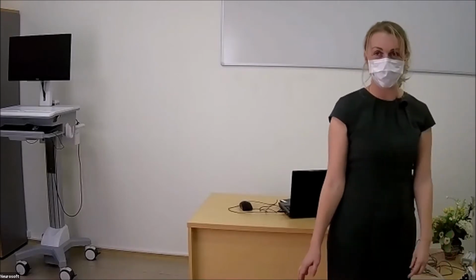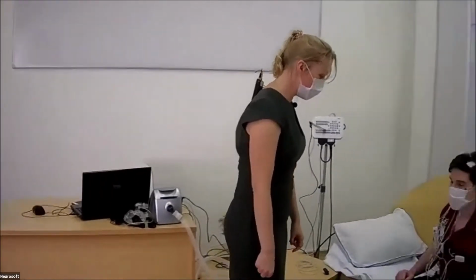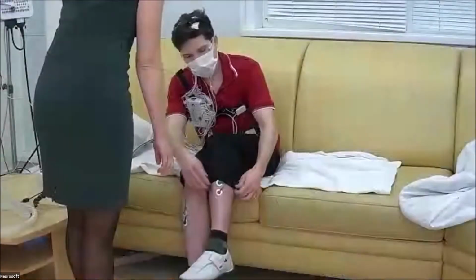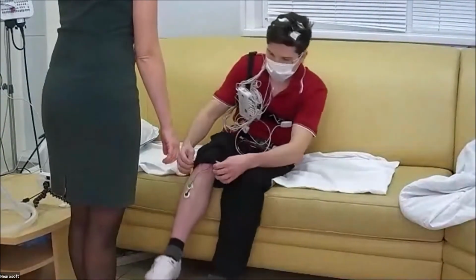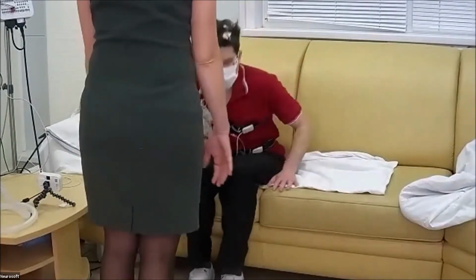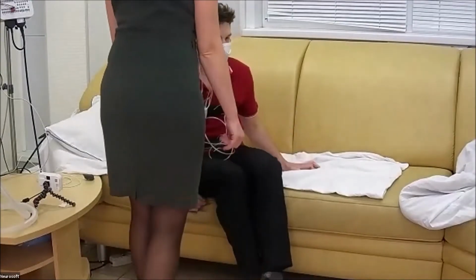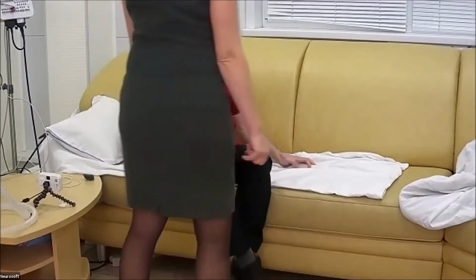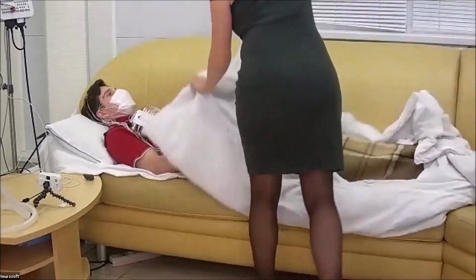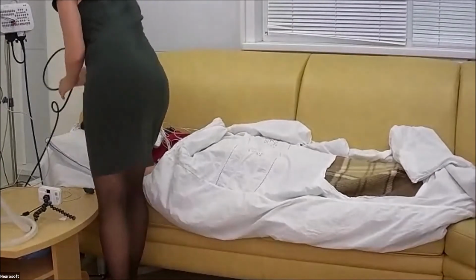So now I've described all electrodes and sensors, and we can ask our patient to lie down and relax. So we need to connect our patient unit to our system, and here we have a cable.